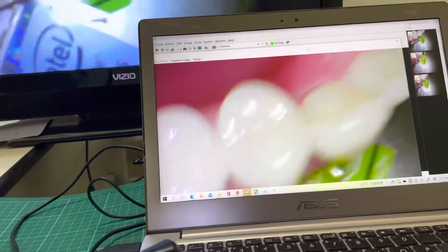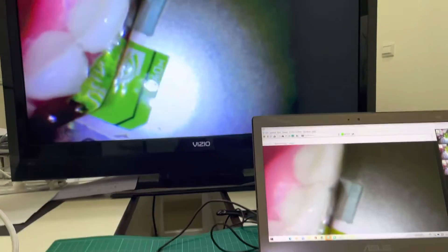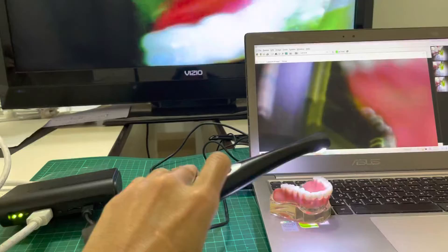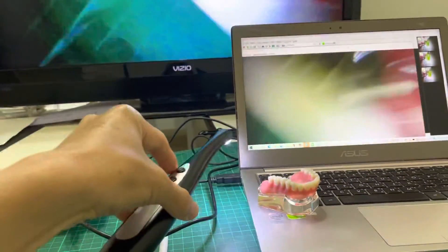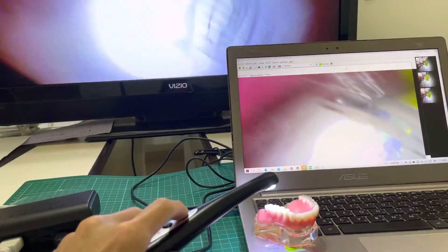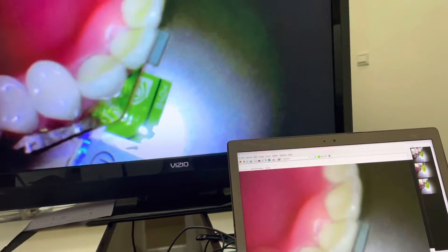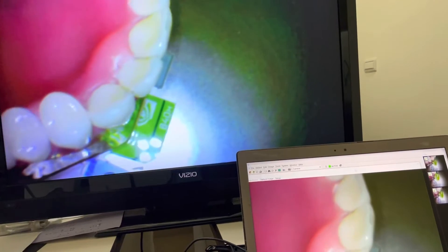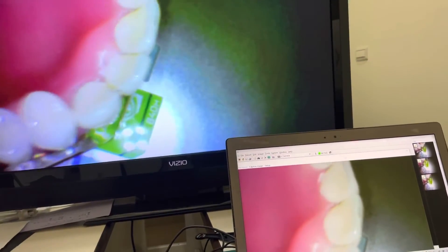So we got three photos. You can see how the wireless Full HD camera is convenient to operate without any cable, with good video quality. I can also use the big LCD TV monitor to explain more to the patient — I mean for the dentist.